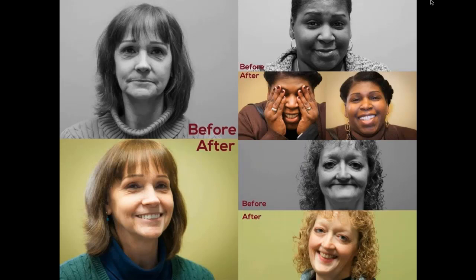However, when you really think about it, making dentures is really hard to do. In fixed prosthodontics, we can move incisal edge positions by 1, 2, maybe 3 millimeters. But with dentures, you have to be really skilled at getting the teeth in the right place. And with digital dentures, you still need to have the same skills to be able to put the teeth in the right place. So that's one of the concepts that really have not changed and why dentures are so fulfilling but yet so difficult sometimes.